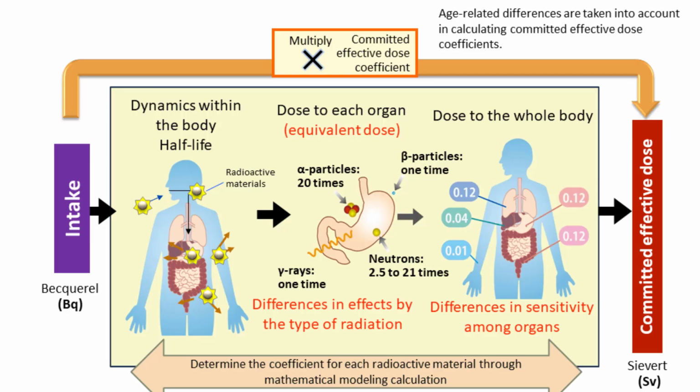We need to understand patient anatomy and how X-ray dose is absorbed in the patient's anatomy. Remember, different tissues have different sensitivity to radiation. We need to select a dose rate that's in line with the patient size and maintain distance from the patient, and use different techniques like last imaging hold in fluoroscopy to minimize the amount of radiation for the patient and the surgery team.